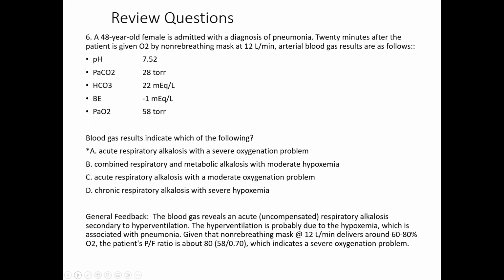Blood gas results indicate which of the following. So you guys can kind of connect the dots there. An acute respiratory alkalosis. So sometimes the actual hypoxemia can be driving this. They're hypoxemic. They're not severely so, but they're modestly so. And that could be the driver there. In all likelihood, it is. There could be something else where they're hypoxemic and they're in some sort of pain, something along those lines, and the pain's causing them to blow off more CO2, but it's probably the hypoxemia that's driving it.